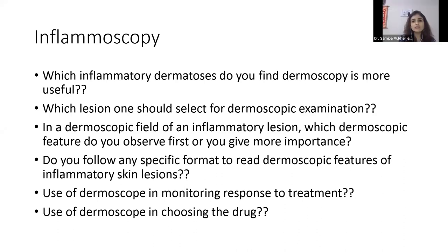Sir, I totally agree, because even for a simple condition like psoriasis, we see that the red dots and globules which were there in regular sheets disappear once you start giving the treatment, whether topical or oral. And I think it is very important because patient compliance improves when you show them these images. Apart from seeing their lesions disappearing on the skin, they see the microscopic changes and they are very impressed with it. As Dr. Enzo has mentioned, we can predict the response or non-response to treatment very early, rather than waiting for the clinical response, which usually takes 15 days or 1 month. If we use dermoscopy on the lesion a few days after treatment, we can predict whether the patient is responding or not.